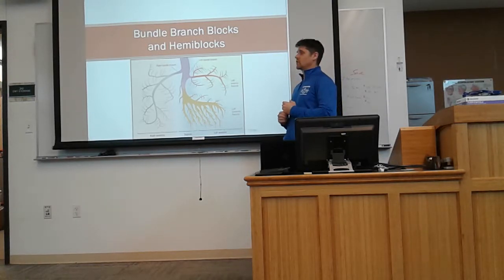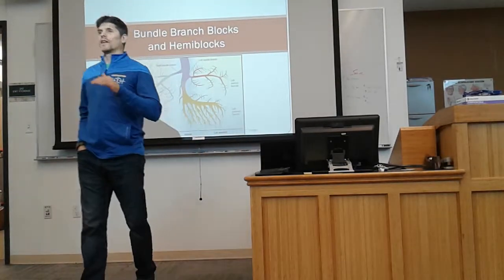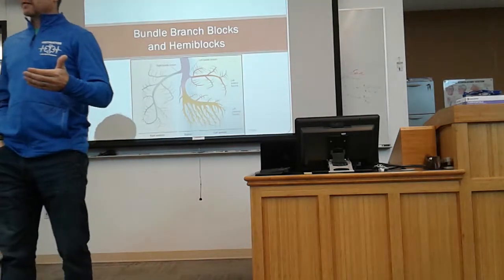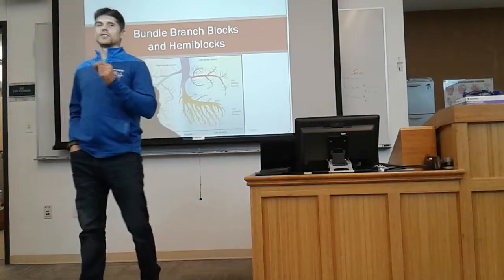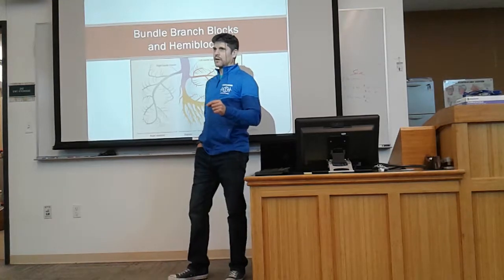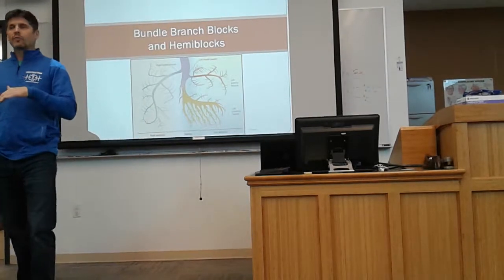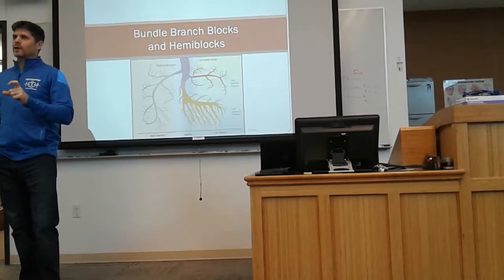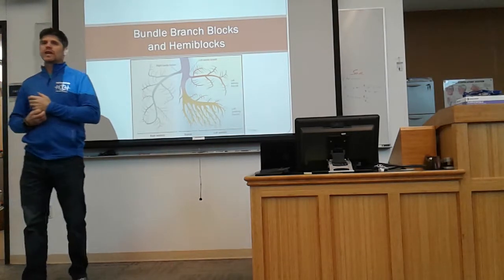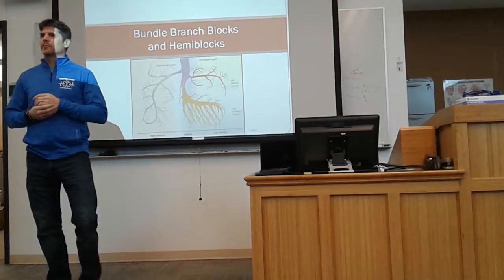You don't need a 12 lead to determine that a bundle branch block is likely occurring, okay? But you do need a 12 lead to determine where that bundle branch block is. Does that make sense? In addition to that, there are some leads where you can tell it's a bundle branch block, but it looks normal enough in that particular lead that you can't quite tell what side it's at. And side becomes important in a couple of different things.